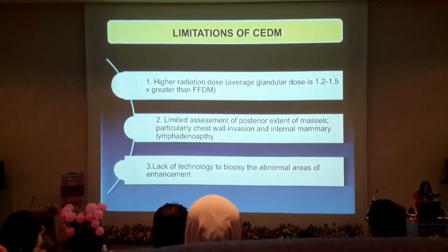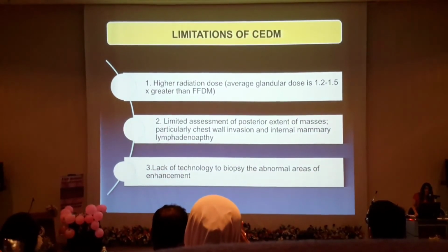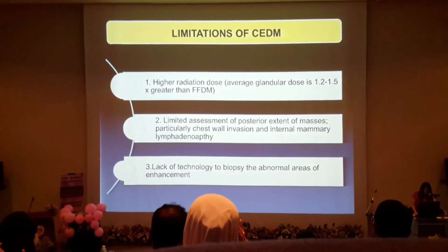So what are the limitations? Yes, the slight increase in radiation dose. Limited assessment of the posterior extent of masses, that's one of our limitations as well, because in MRI you can see the posterior extent, whereas that's a bit of a limitation in mammogram.